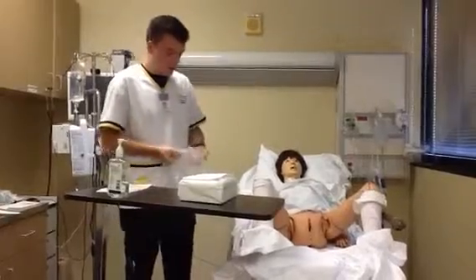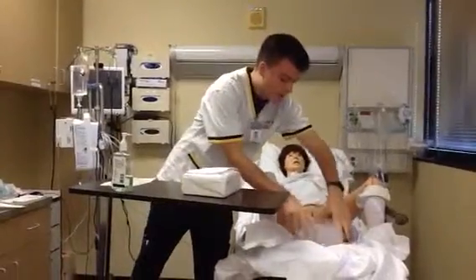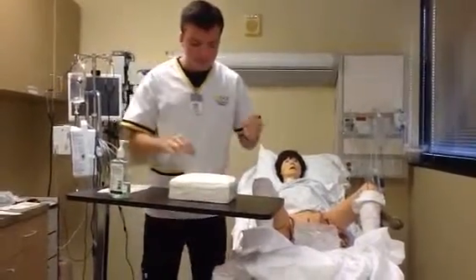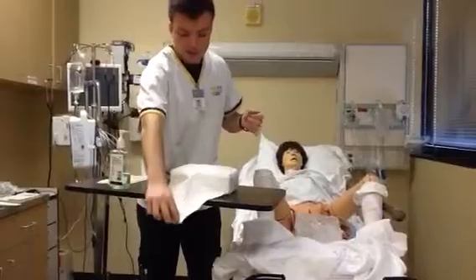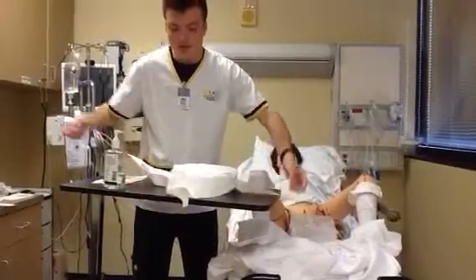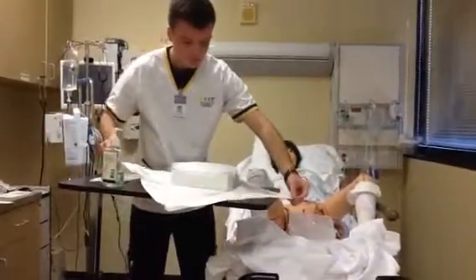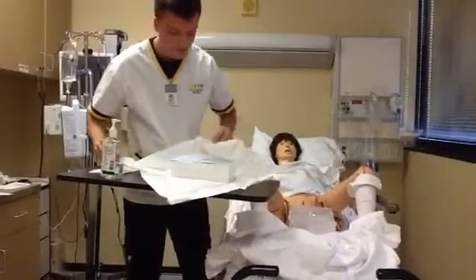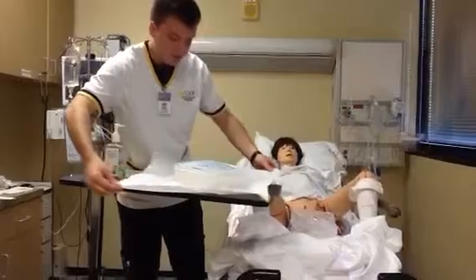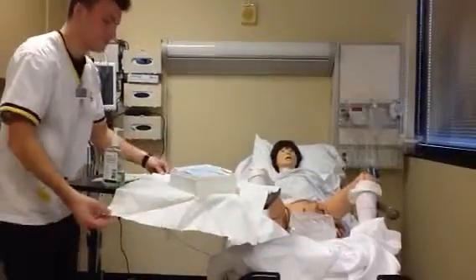Going to save the plastic bag and use it as a trash bag. Going to do the outer flap, the side flaps, and during this entire process I'm making sure to only touch within the 1-inch borders at all times. Again, always making sure that I'm touching within the 1-inch borders, and that I am not reaching over my sterile field, and that my sterile field stays in front of me the whole course of the procedure.